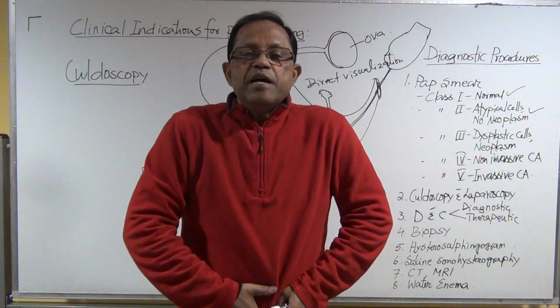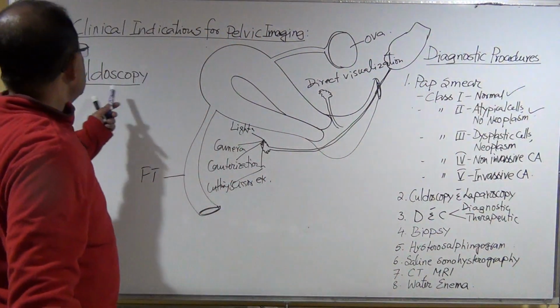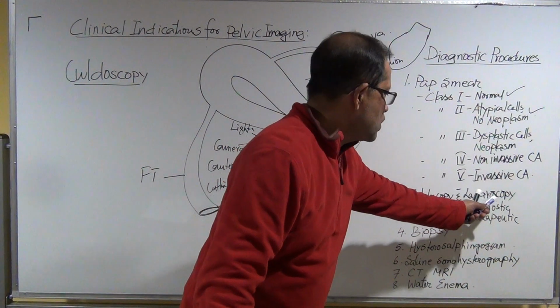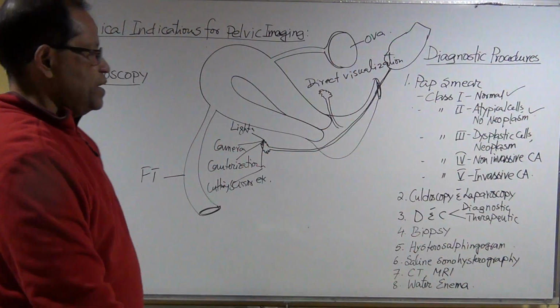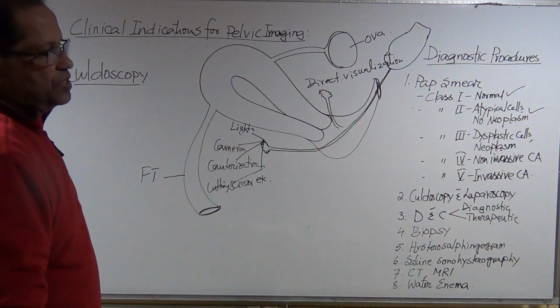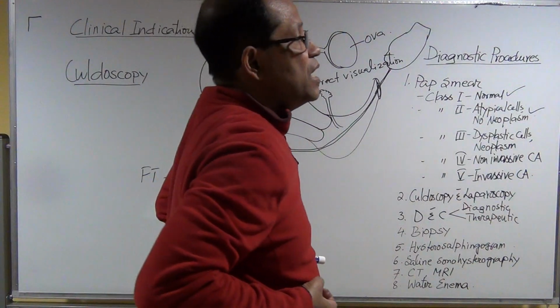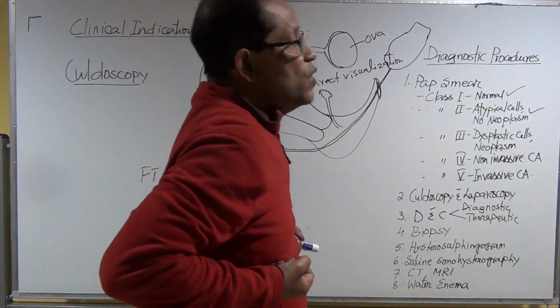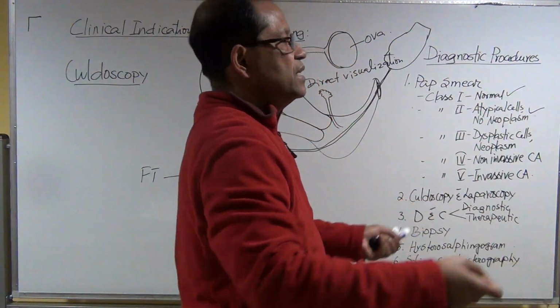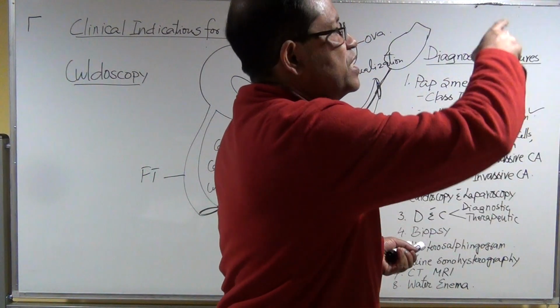So it is better to see direct visualization, that is known as scopy. Scopy means laparoscope, laparoscopy means direct visualization. I like to see through the instrument, okay, send the instrument into the abdomen and I'm moving up and down, side to side, and I see all the pictures in my monitor.